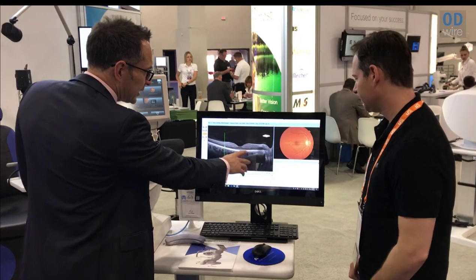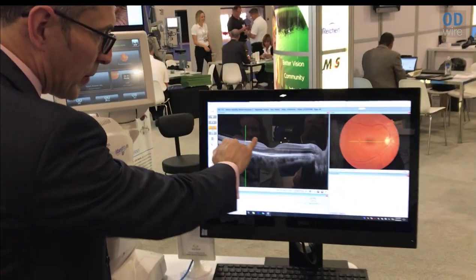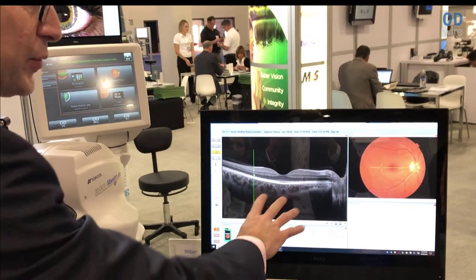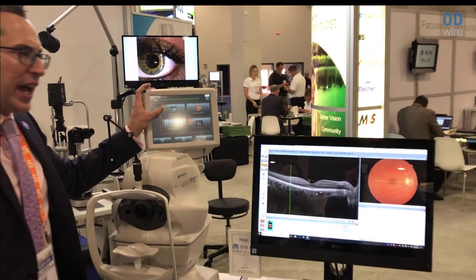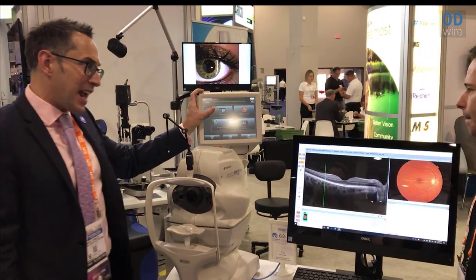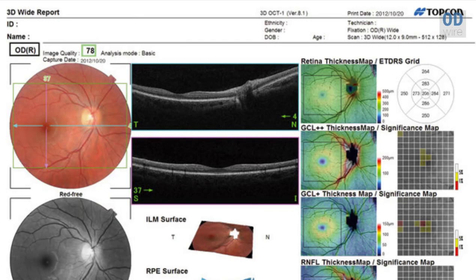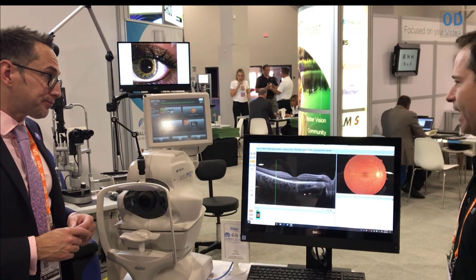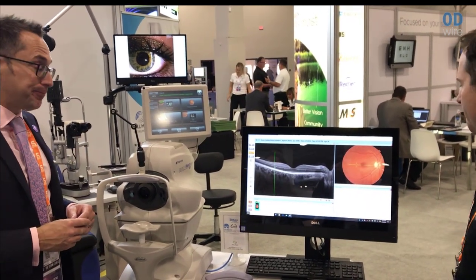You can see really high resolution images — you can actually see the fovea centralis here. All of this information is captured in that second. We also have what we call our wellness scan, a 3D wide scan with wide field imaging, which gives you the macula and the disc in one simple scan. That's going to give you macular thickness information, ganglion cell information, and your nerve fiber layer — all in one strike. And it actually goes pretty quickly to take that scan as well — same speed.